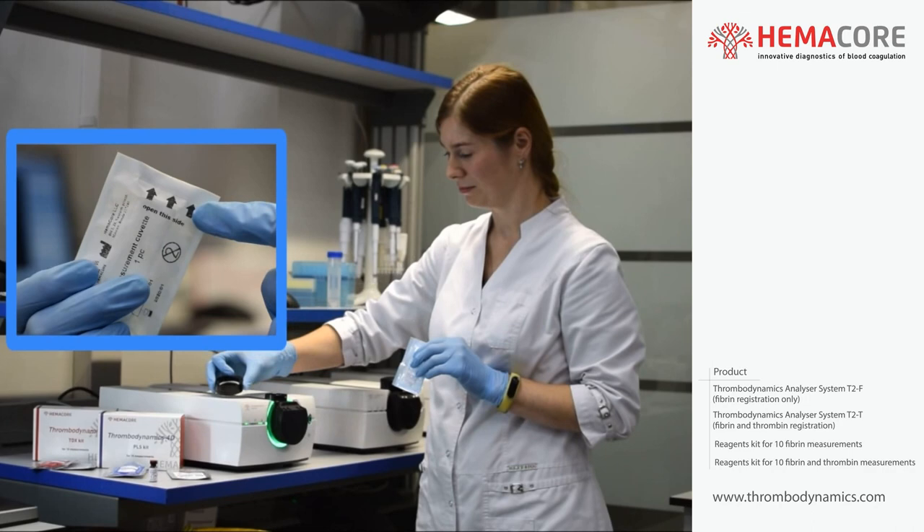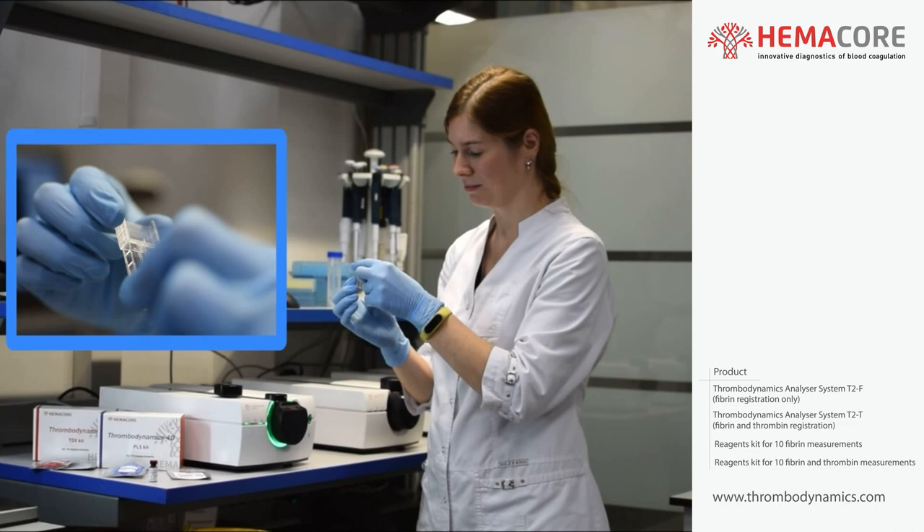Prepare the cuvette. Take off the thermostat cap. Withdraw the cuvette from the protection package and place it into the thermostat.